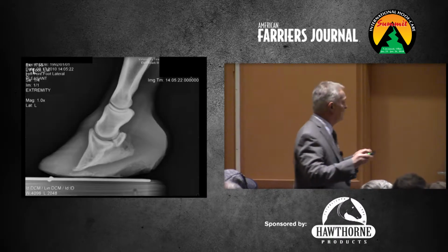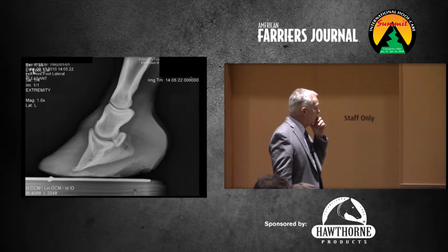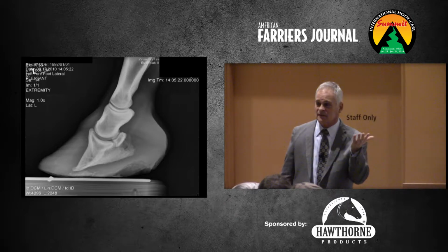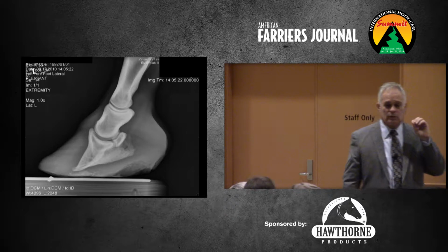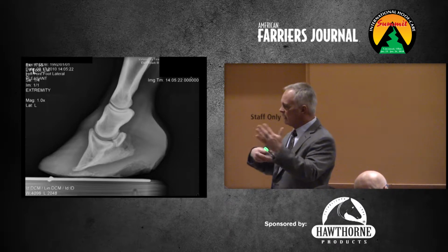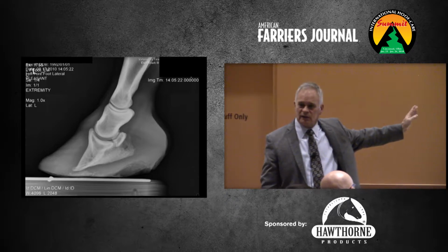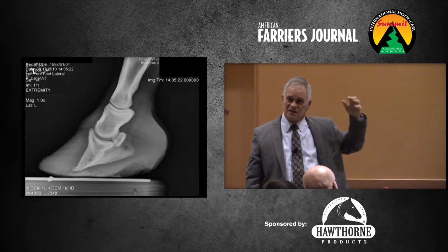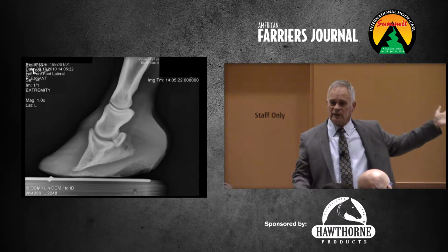And so this is her lateral. All right. And so now why do you think she got sore? So that's, yeah, so this one, it's malalignment of the distal phalanx and hoof capsule. You'd have to really look and make sure this mare wasn't actively laminitic, but this was just trimming that got away from the farrier. And so how would this horse grow?